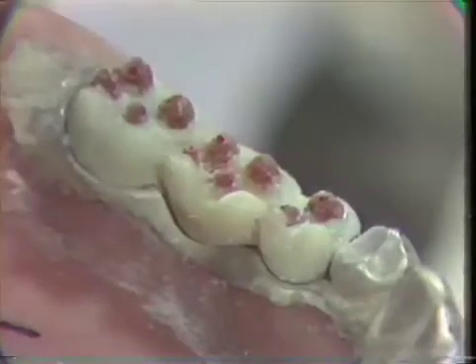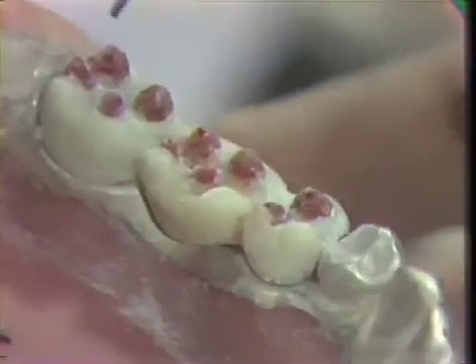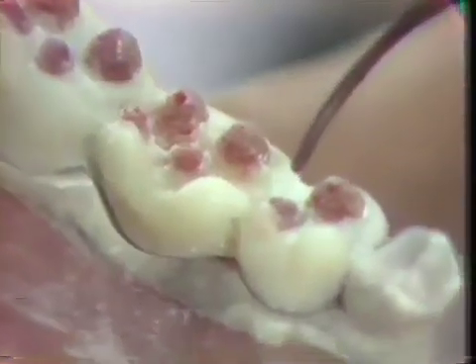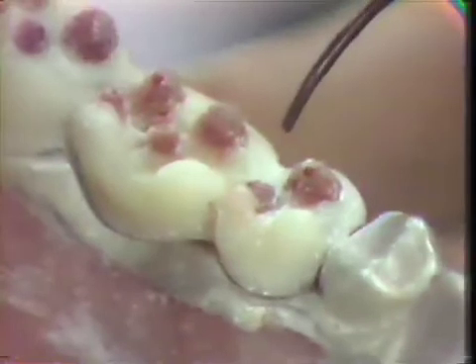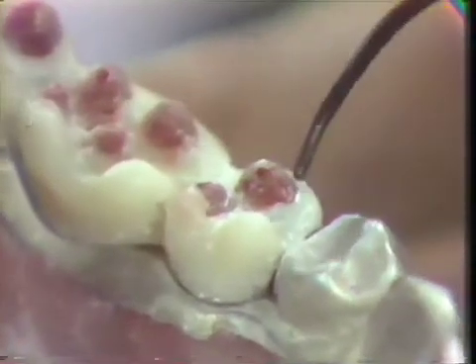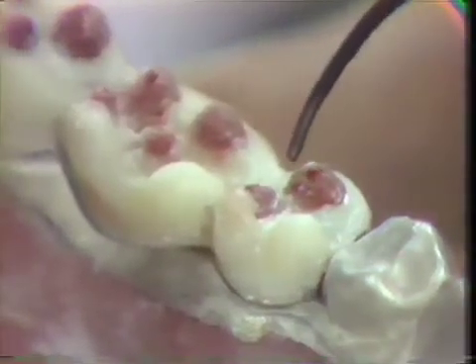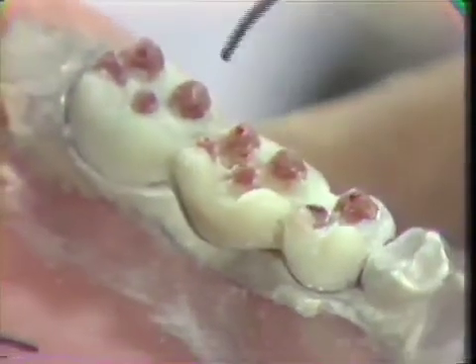We've now completed step 3, the non-supportive cusps, those being the lingual cusps, the mandibular molars, and the bicuspid. And we'll now move on to step number 4, which will be the development of the marginal ridges and the cusp ridges, each cusp having a mesial and a distal cusp ridge. We'll switch colors here and go to green wax to further emphasize the differences between each of these parts.